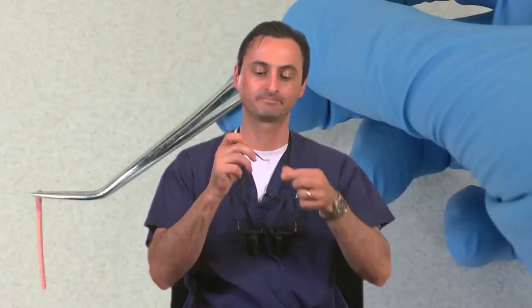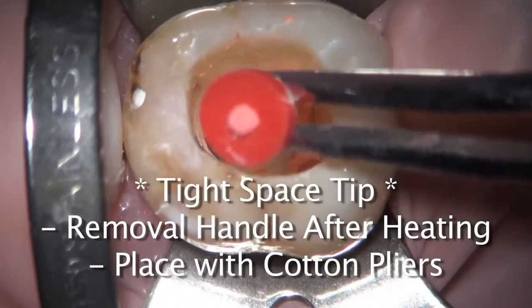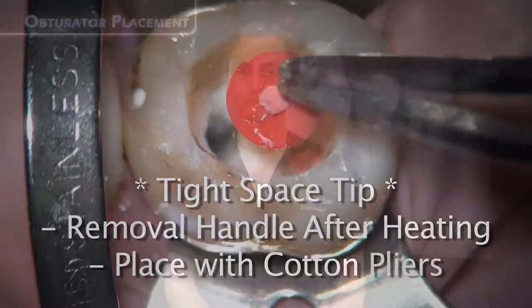The ability to break off the gutta core handle and turn the obturator into a shorter and easily maneuverable instrument separates this from other warm obturation systems on the market. Many obturation systems may enable you to obturate with warm gutta percha, but please ask yourself if they can be used easily, predictably, and comfortably in more difficult-to-reach sites.